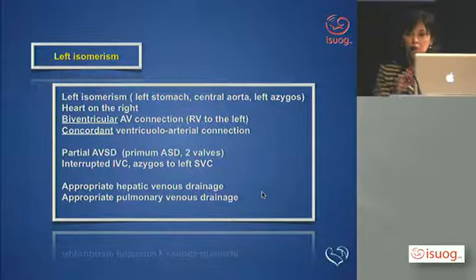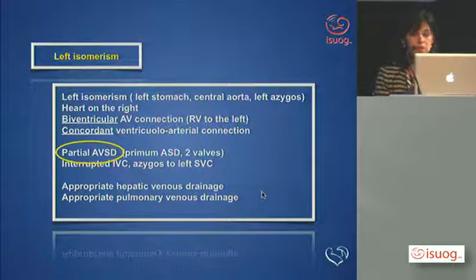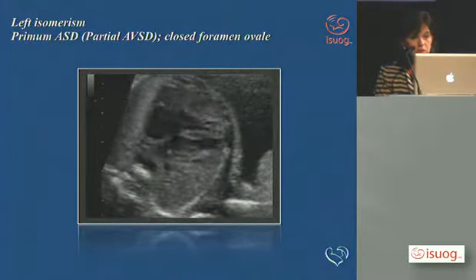So once you've worked it out, all of that can be summarized in terms of hemodynamics as a primary ASD, because all the connections, although they're going through different pathways, are going into the appropriate atrial chambers, which connect to the ventricles they need to connect to in terms of flow circulation, rather than the anatomy necessarily. And this is an example of such a case.